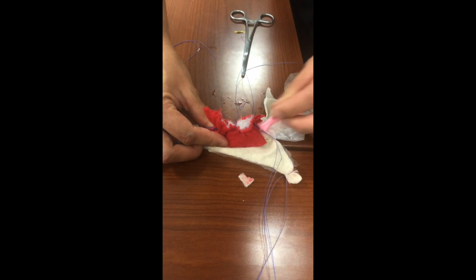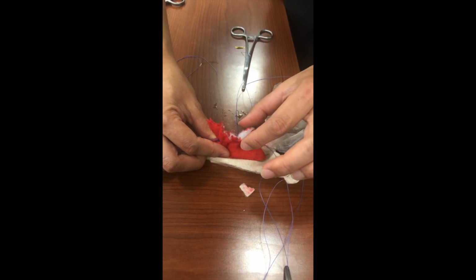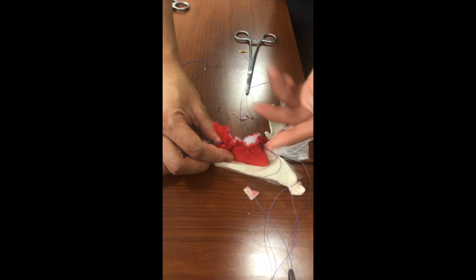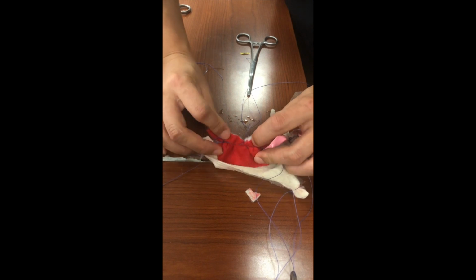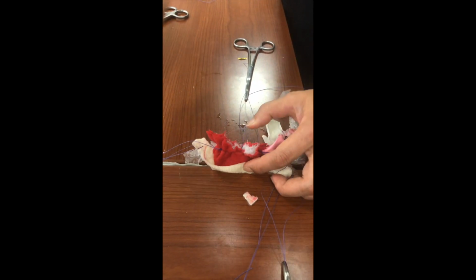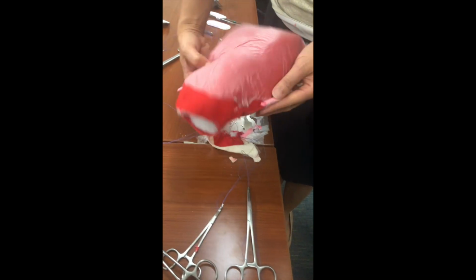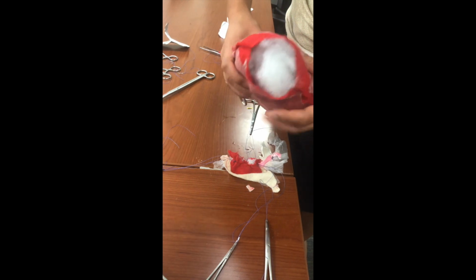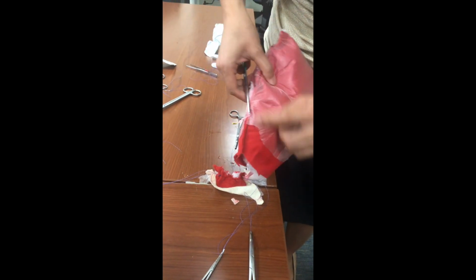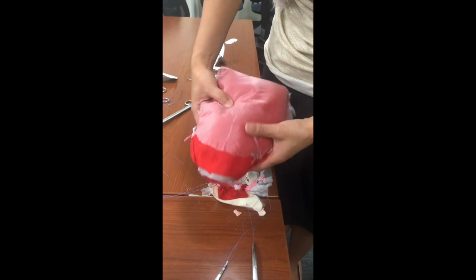Now you have completed a supracervical hysterectomy. Here is your vaginal cuff from the transected lower uterine segment. You have a figure 8 stitch in the middle and a Heaney stitch on each side of the vaginal cuff. This model can be reusable after replacing the uterine artery with new water balloons. And this is how you complete a peripartum hysterectomy.